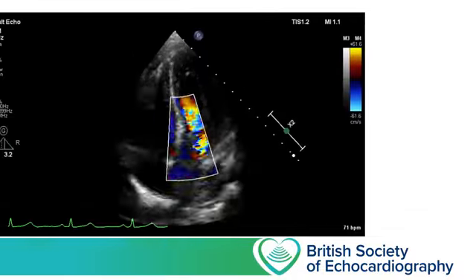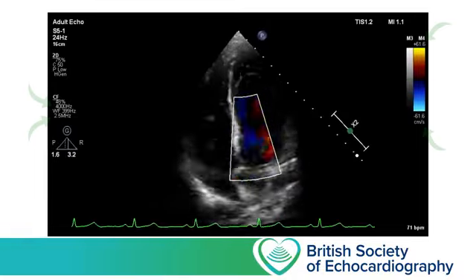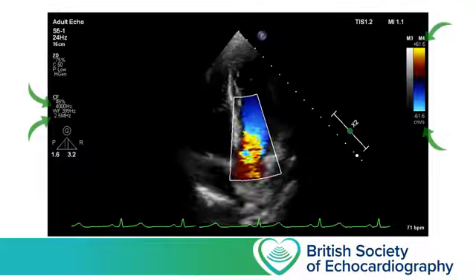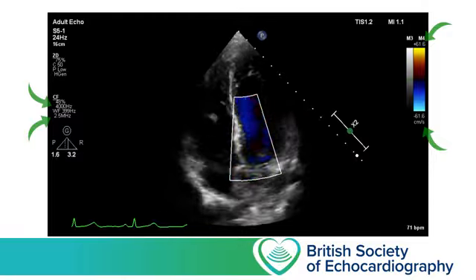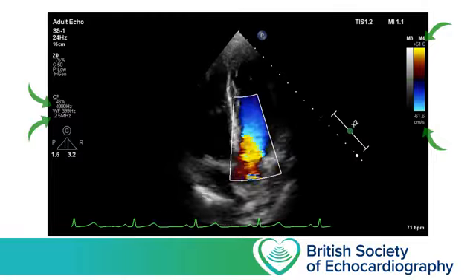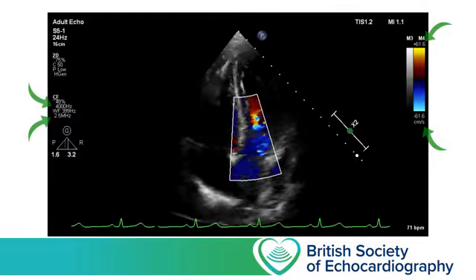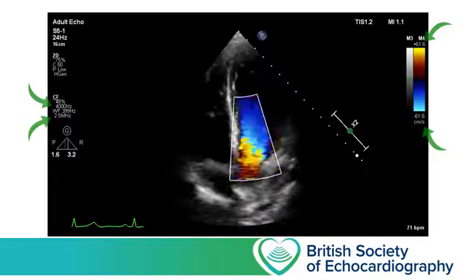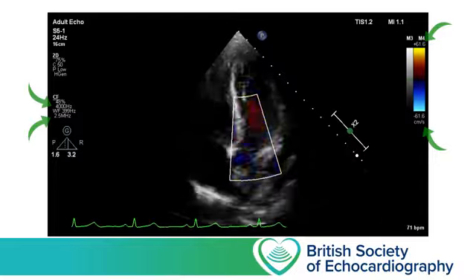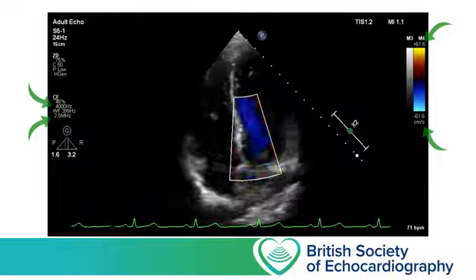Okay, so here's another apical 5 chamber, this taken from a healthy volunteer. And on the left hand side of the image we can see that our transmitted wave has a frequency of 2.5 MHz and our pulse repetition frequency is 4000 Hz. And if we have a look at the scale on the right hand side of the image we can see that the maximum discernible velocity in either direction is 61.6 centimeters per second.